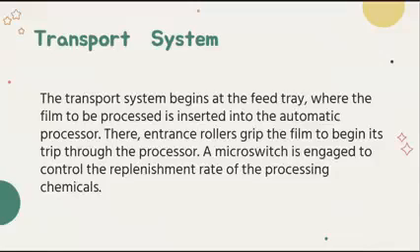Always feed the film evenly using the side rails of the feed tray and alternate sides from film to film. So, yun na, sinabi ko kanina. This ensures even wear of the transport system components and ensure proper replenishment rate is maintained.